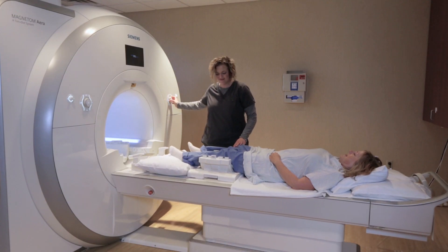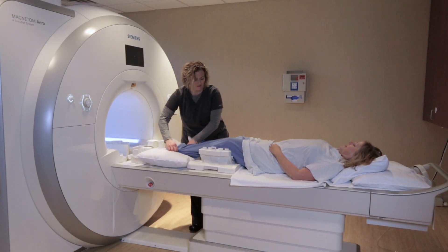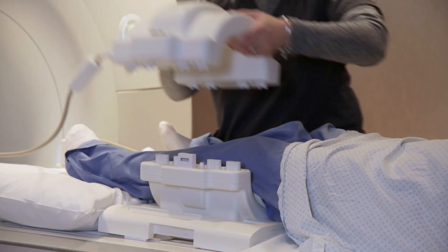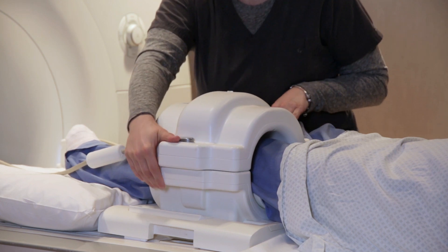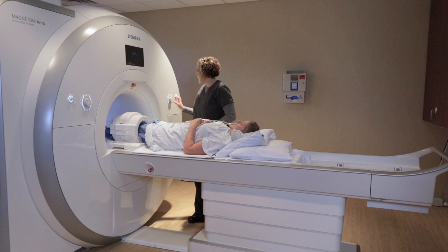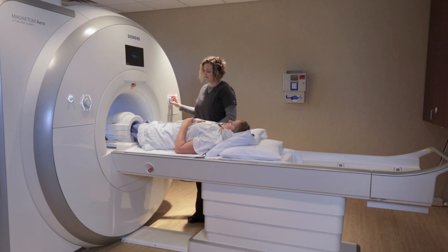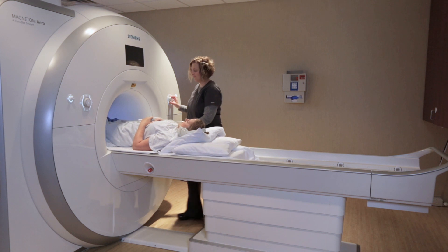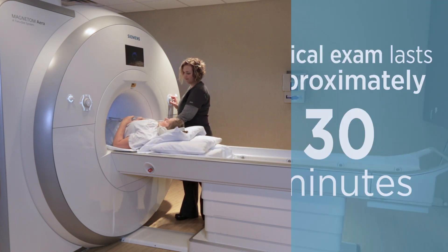A knee MRI is one of the easiest MRIs to have. You're going in feet first, and it's a relatively short MRI. The patient is going to be laying on the table on their back, and their knee is going to go in a special knee coil. Whatever part is being imaged goes to the center, so with the MRI of the knee, the knee goes to the center of the scanner and their head is not in the machine.